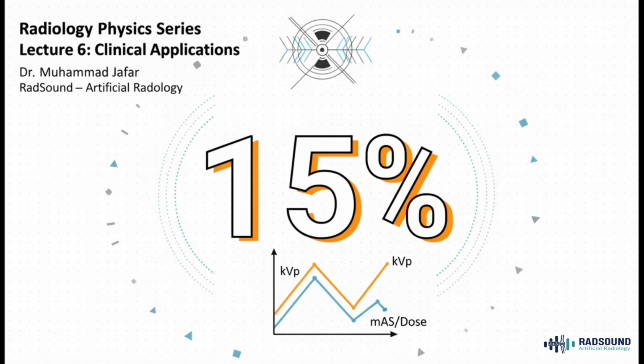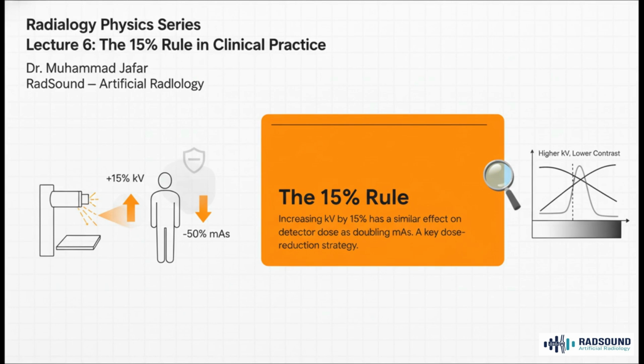Now, I want you to remember this number. Just burn it into your brain. It's one of the most useful clinical rules of thumb in all of radiography. 15%. And here's why that number is so powerful.